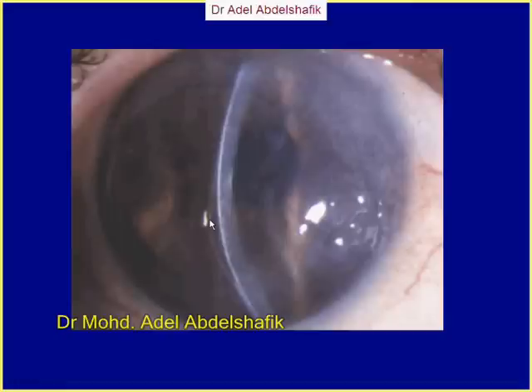So actually we are seeing a case of corneal edema, because here the thickness is increased and even the edema gets forward toward the epithelium. You know that the epithelium is a barrier preventing the passage of aqueous, either from out in or from in out. That's why fluid accumulating in the stroma accumulates under the epithelium, and the epithelium starts to be elevated, and we say we get a large bulla.